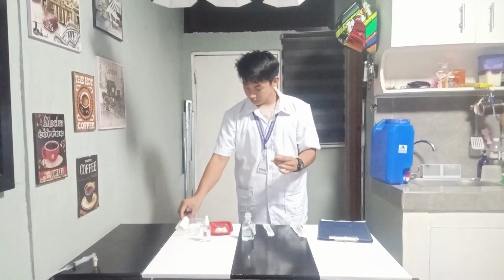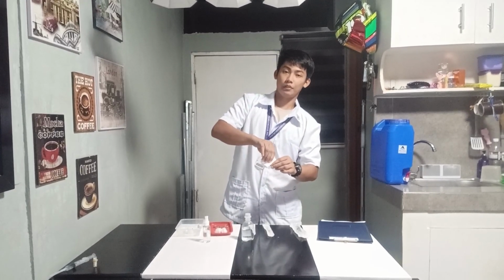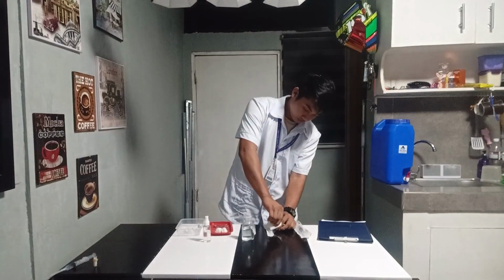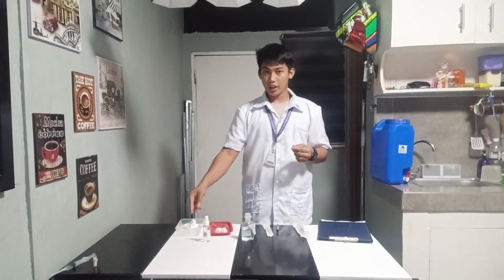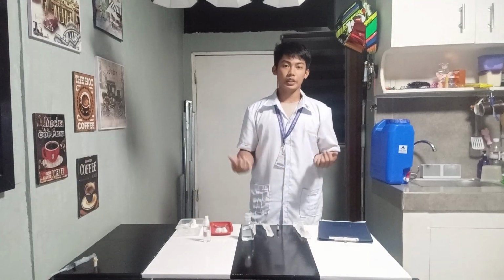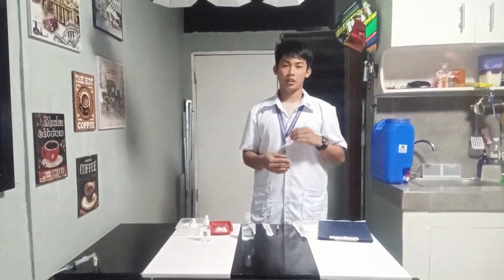Now place a sterile gauze pad around the neck of the ampule, then we're going to break it with a snapping motion, with the broken parts directed away from our body, so we don't get cut. So take the gauze pad around the head, and then just snap it off. Then you're going to take this head of the ampule and dispose of that in the sharps bin, so you don't cut yourself along the gauze.